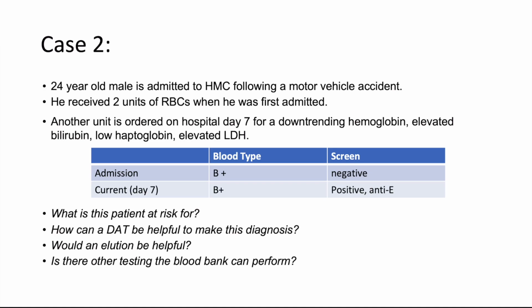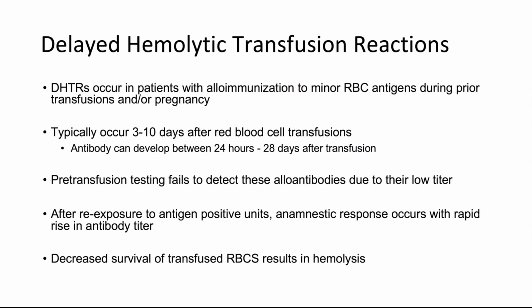If you're watching the video, you can pause here and answer the questions, but then, what's the patient at risk for? How would a DAT be helpful? Would an elution be helpful? And what other tests can we do?